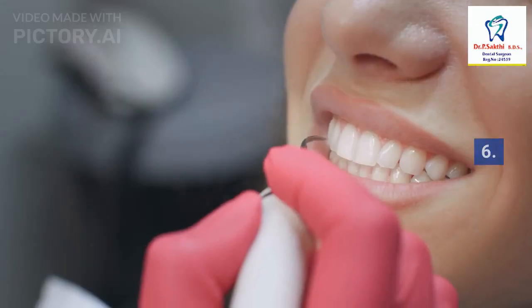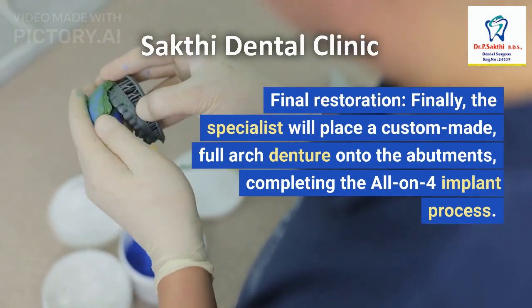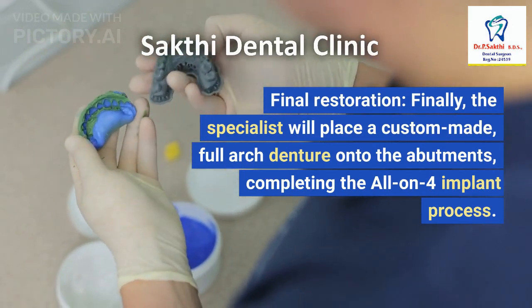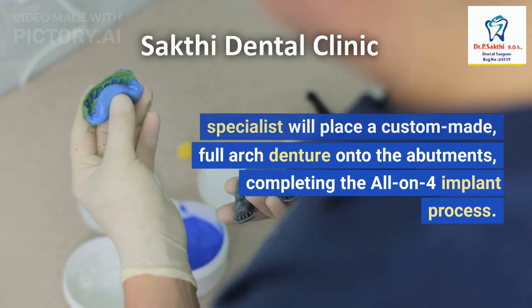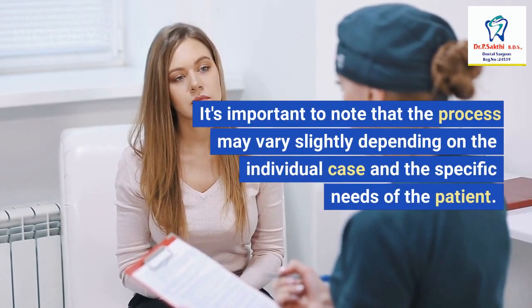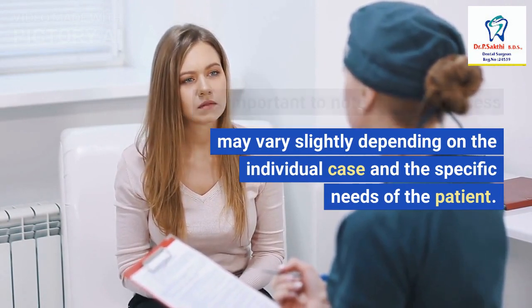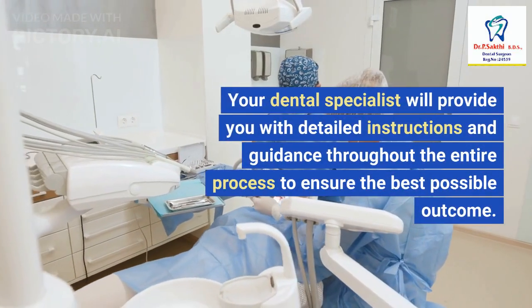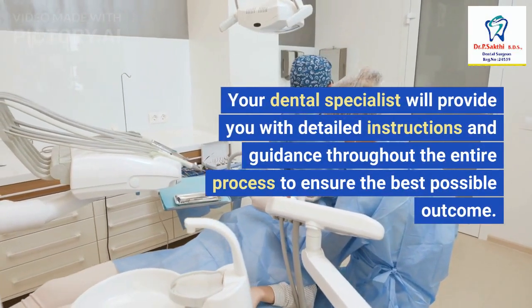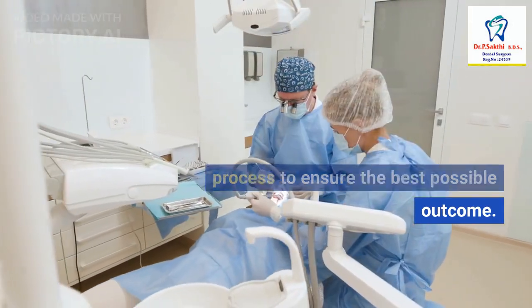6. Final Restoration: Finally, the specialist will place a custom-made full arch denture onto the abutments, completing the All-On-4 implant process. It's important to note that the process may vary slightly depending on the individual case and the specific needs of the patient. Your dental specialist will provide you with detailed instructions and guidance throughout the entire process to ensure the best possible outcome.